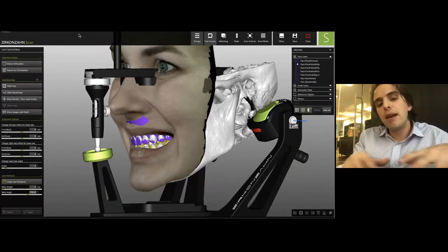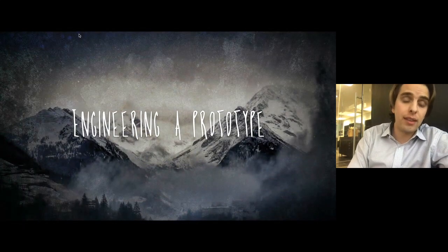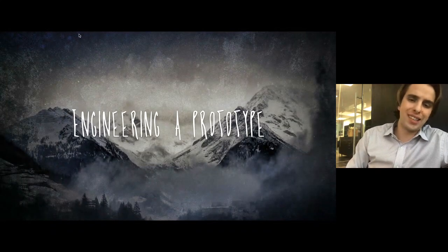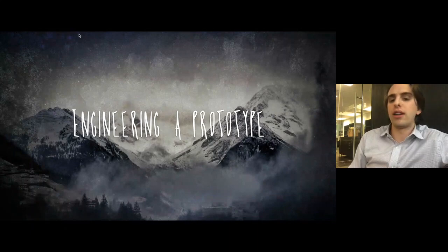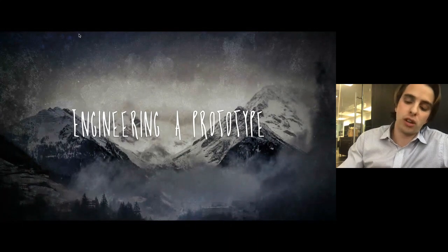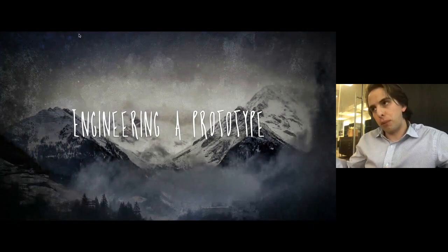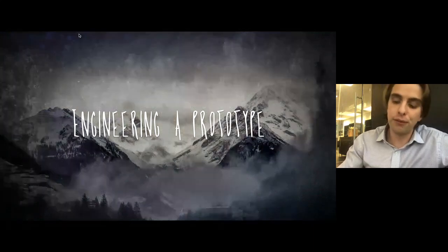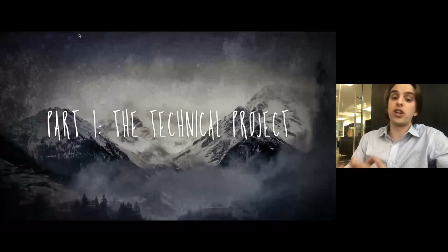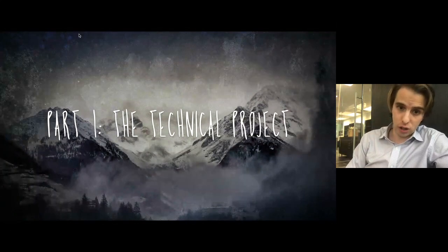And this will be the premise of our prototype. This is going to be the starting point of the technical project to engineer a functional and aesthetic prototype for full arch immediate provisionalization. And we need to lay this project out in a couple of steps. So the first step is going to be about actually establishing the technical project so you have the 3D patient registered on your virtual articulator.